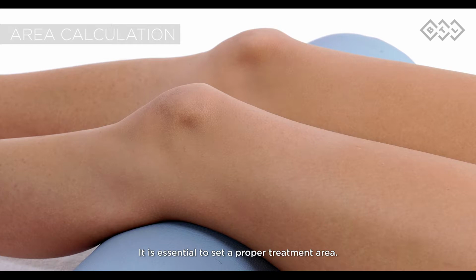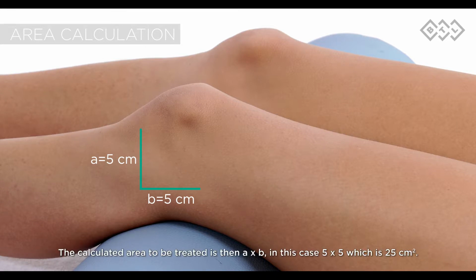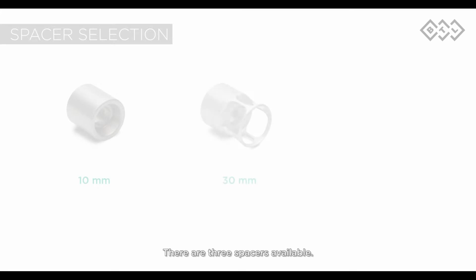It is essential to set a proper treatment area. To calculate the area to be treated, estimate sides A and B of a rectangle. For example, A equals 5 centimeters and B equals 5 centimeters. The calculated area to be treated is then A times B, in this case 5 times 5, which is 25 square centimeters. There are 3 spacers available.